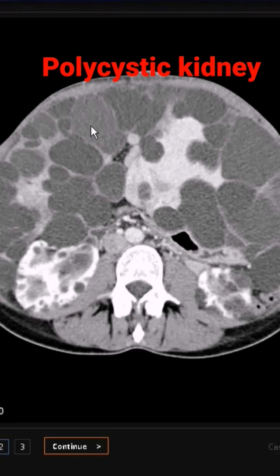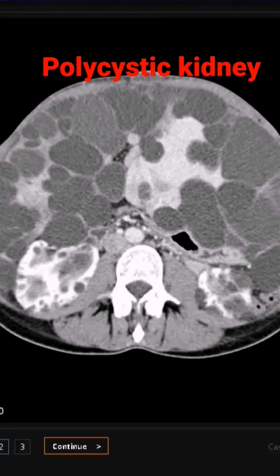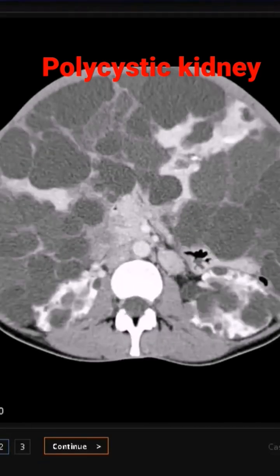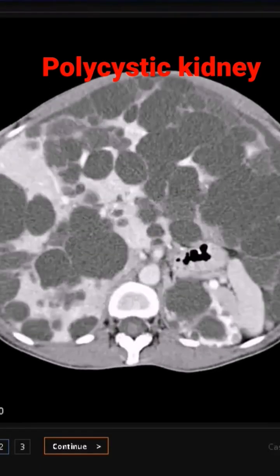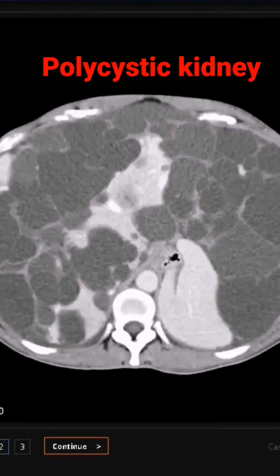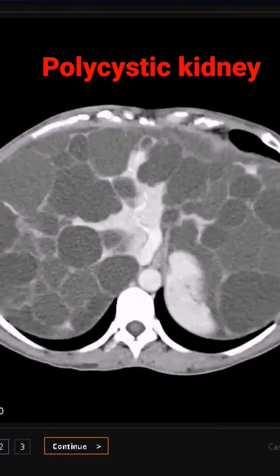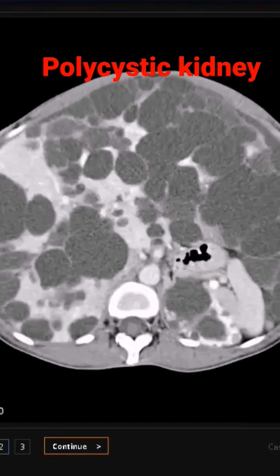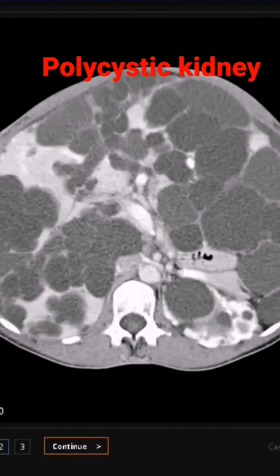As we examine further and go upwards, we can see some of the cysts in the liver as well, reaching upwards, but there's not much else to notice here. The kidneys are the main focus, and we can plainly see that the cysts have involved both the kidneys and the liver.